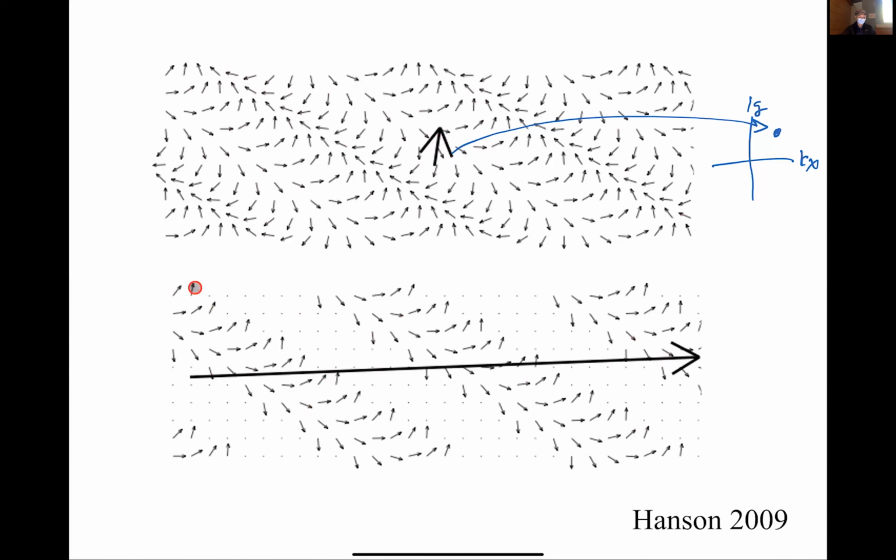So once again, let's say my object is this bar of chocolate, but it's got zeros all in these regions. I impose a spatial pattern. The spatial pattern is this, right? But because it's 0 here, I essentially get rid of these spins. Previously this spin was canceled out by this spin here, but this spin's no longer here. So when I add everything up, we get this constructive addition, and I get a much bigger value for my Fourier transform. So you've got encoding, you've got multiplication, and you've got integration all right there.